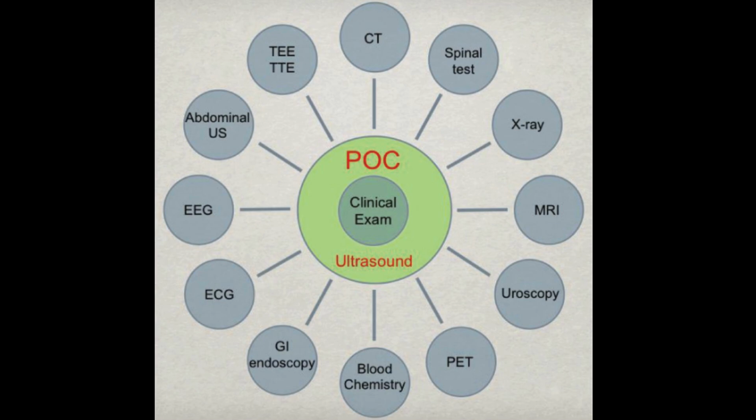And you know as well as I do that examination can only take you so far. To get more information, you need to use an alternative device. And that's what the ultrasound's about. To be able to just see, is this because of something else? What am I missing here? Why is there free fluid? Why am I struggling with ventilation? All these things, with a clinical exam, are actually quite difficult to know, especially in the ICU environment. The patient often can't talk to you. So this is where you need a little bit of extra tools.